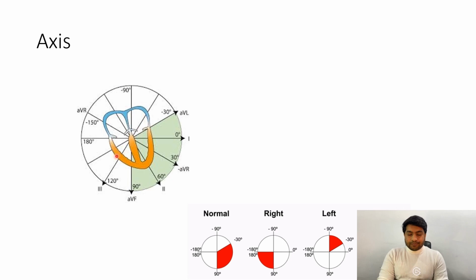So let me explain this figure a little bit. This is our isoelectric line, right? The one resting on the baseline in the horizontal plane. Since we know that the flow of current is from here to here, we can say that this is our positive side towards which current flows. So this is 0, positive 90, this is negative 90 and this is 180 degrees.